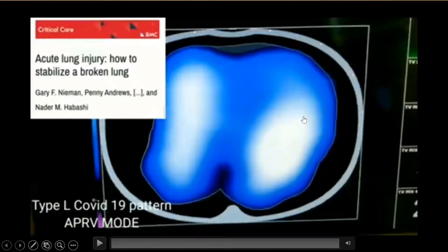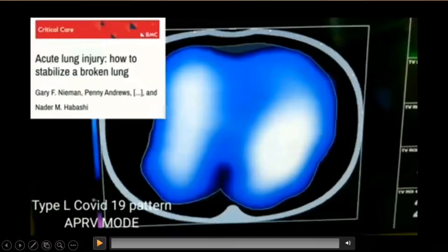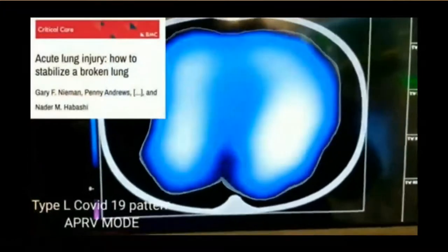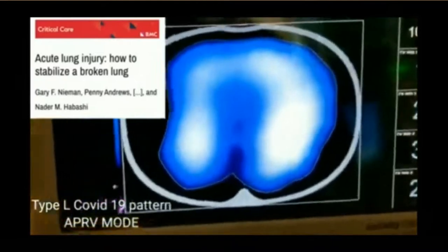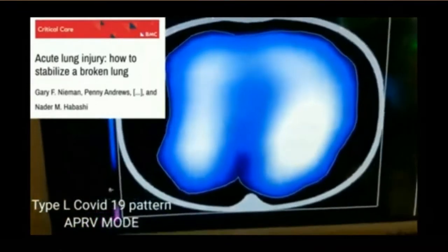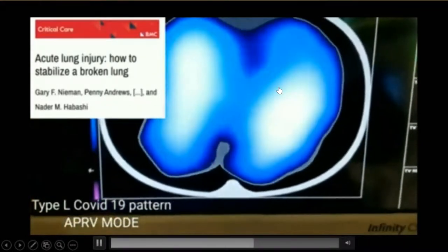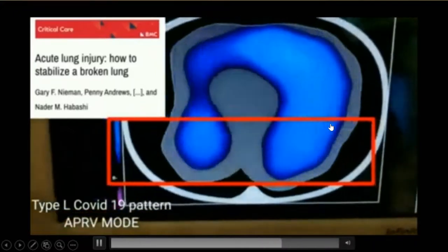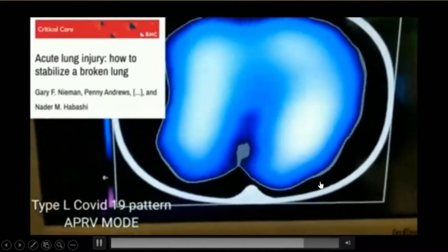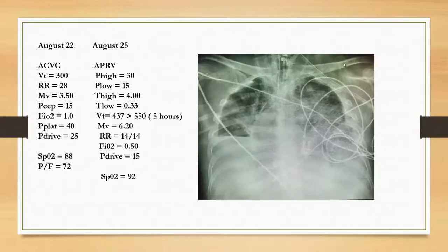Here is the dynamic image. There's the release phase back to the CPAP level. The T-high here isn't very long — probably around 2 to 2.5 seconds. Nice distribution. That increased inspiratory time on the T-high allows for collateral ventilation, better distribution, and nice recruitment of the dorsal gravity-dependent regions. Here's an example of a patient who had bowel surgery that went wrong — required return to OR, large amounts of fluid, third spacing, albumin infusions, and the patient developed DIC.